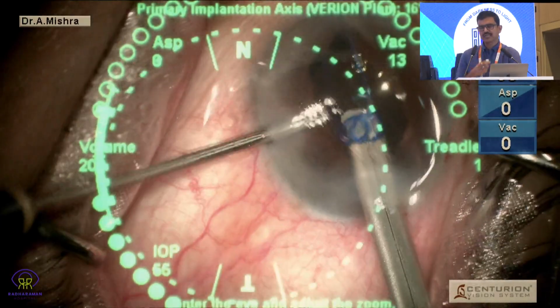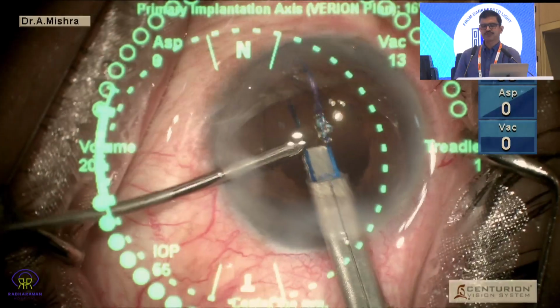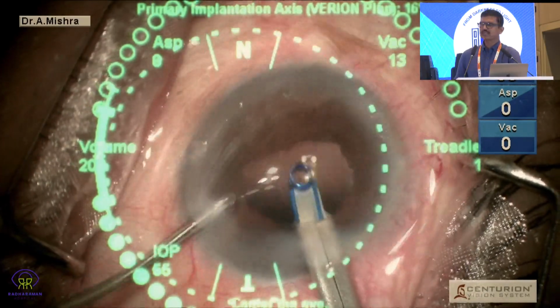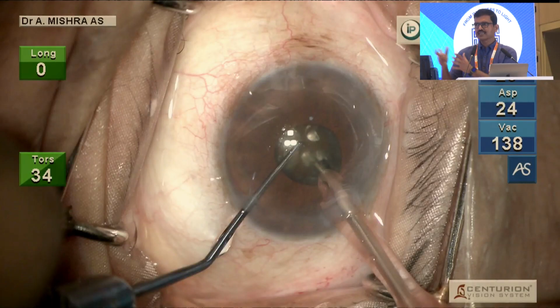Of course, the second instrument plays a very pivotal role, which is the irrigation cannula in this case. You have to dab the side scroll so that they go in, and then counter pressure distally just to disengage the distal scroll. Now, all this is regarding the dilatation of the pupil.